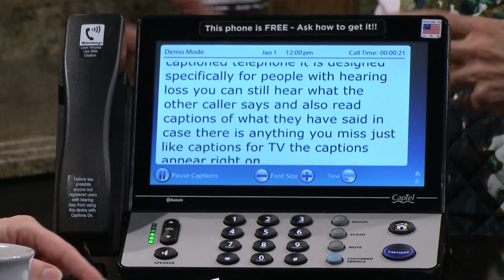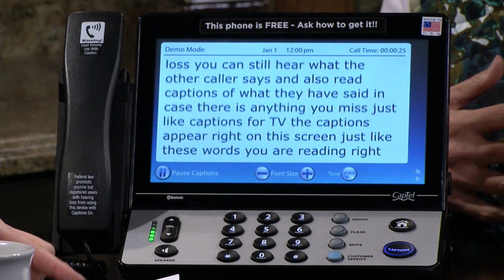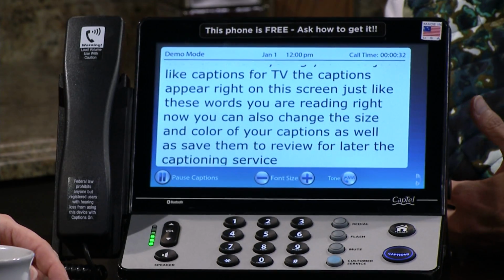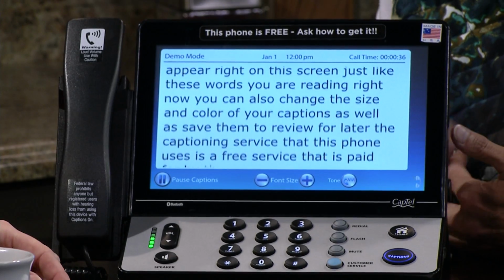Now you mentioned that it's closed captioning. So is that like the TTY, the text telephone? The text telephone was if you're the user, the individual with the hearing loss, I'm typing something to you, you're reading it, and then you're typing something back to me. With the CapTel, we're actually having a real-time person-to-person conversation where you're able to hear what I'm saying to you, but you're also seeing everything that I've said to you. Okay, so show me how it works.